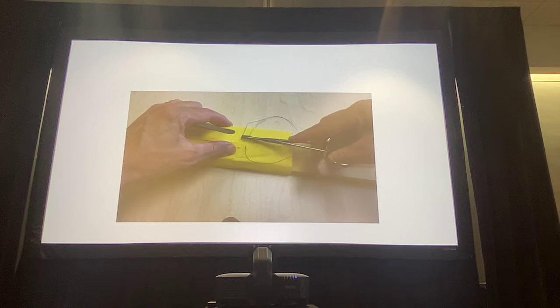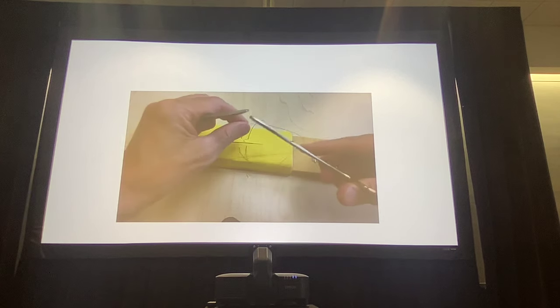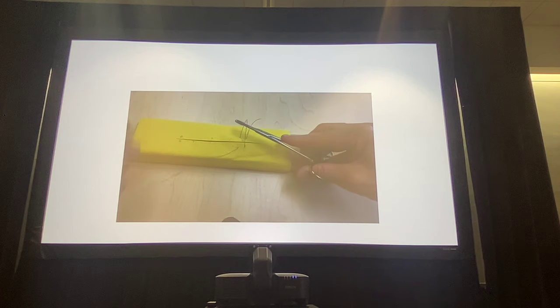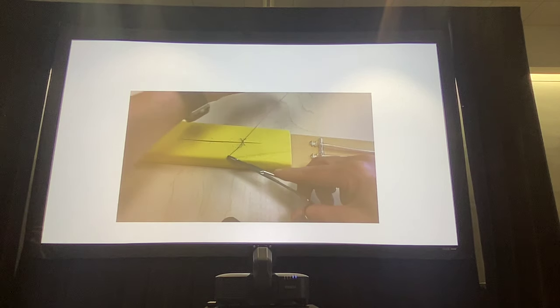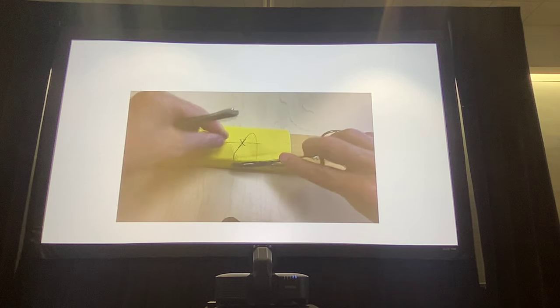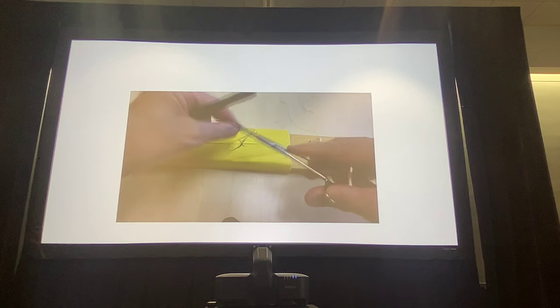Let's say you're removing a skin tumor from a dog over the sternal area, and the dogs are going to put a lot of pressure on their sternum. This is great for that because you're going to have tension there from the way their chest is concave, and they're going to put pressure on your incision just from walking around the house and laying down. So a cruciate pattern is a nice way of giving extra support because it does help with tension, and it's great for that.